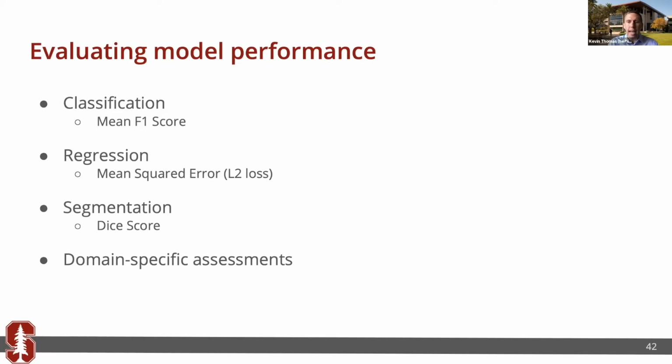Now, a different task is regression, which is the idea of assigning a numerical value to each item, each piece of data, each observation or subject you might have. So this is valuable, for example, if you want to assign disease severity scores to each of your subjects based on data you've collected from them. And a third common task that's automated with deep learning is segmentation, which focuses on finding the important parts of a larger image. So the example I gave before was that you might want to segment the cartilage in your subject's knee MRIs so that you can then measure the health of that cartilage.